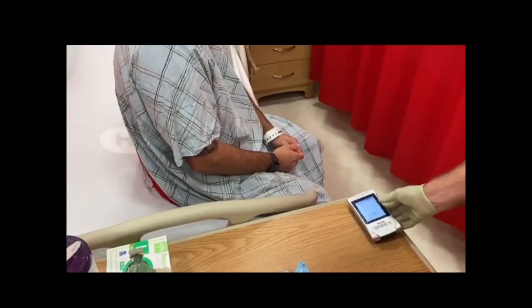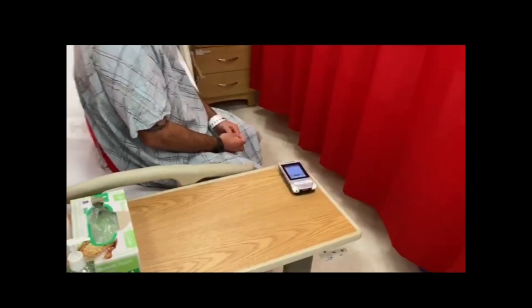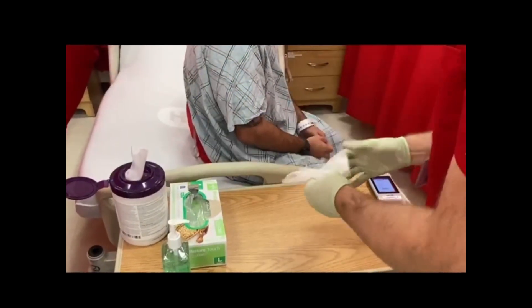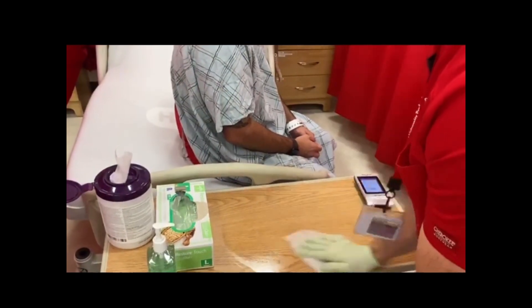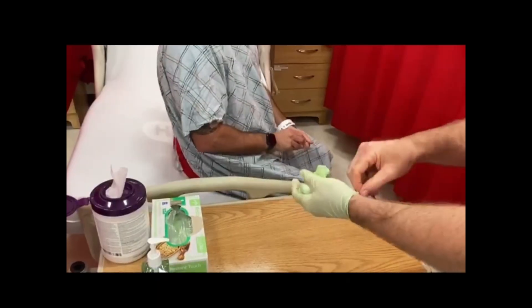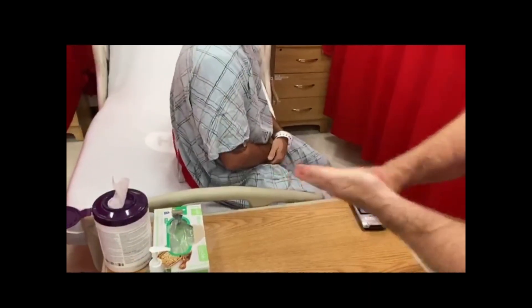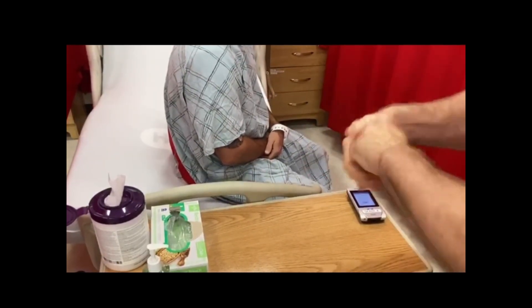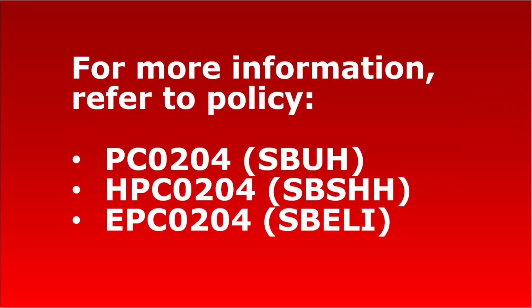Gather all waste and discard. Disinfect the used surfaces. Remove gloves. Perform hand hygiene. Take the glucometer and exit the patient's room.